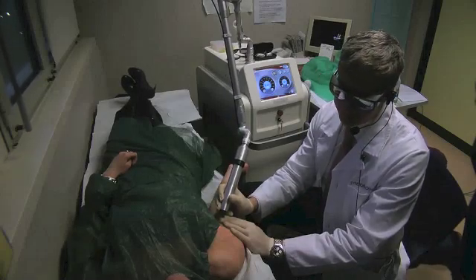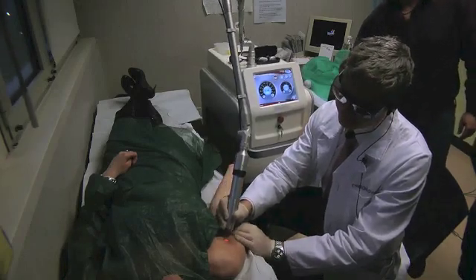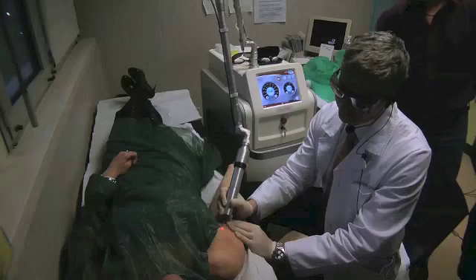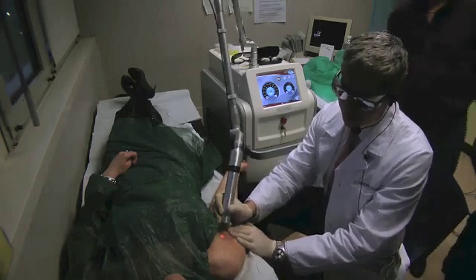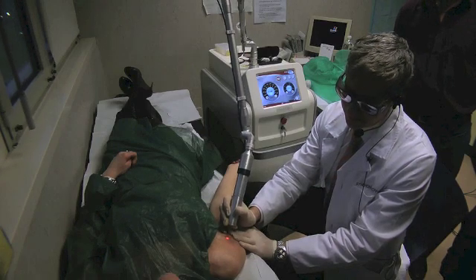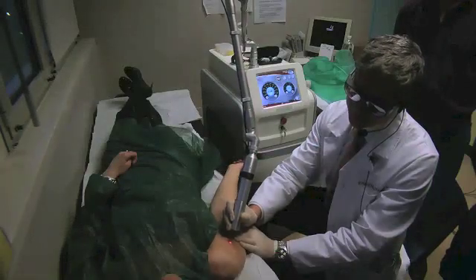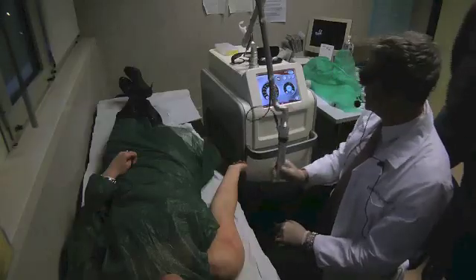How is it? Painful? The patient is smiling. So another pass. How many passes do you suggest? Usually I do three passages. The energy level — the fluence level — is moderate because this wavelength is much more aggressive than the 1064. Obviously you don't get a lot of the so-called popcorn effect. This is exactly the level I used to treat the patient shown in the presentation. We are done with the test.